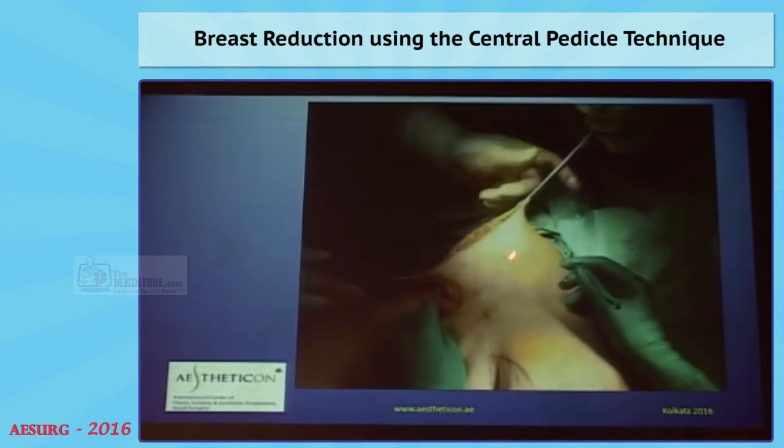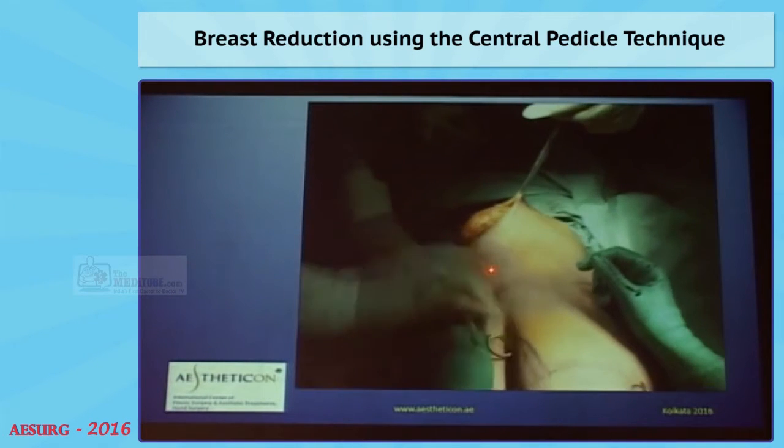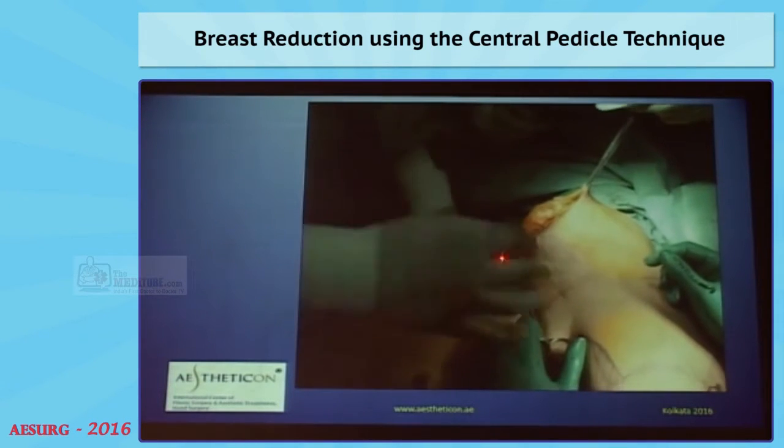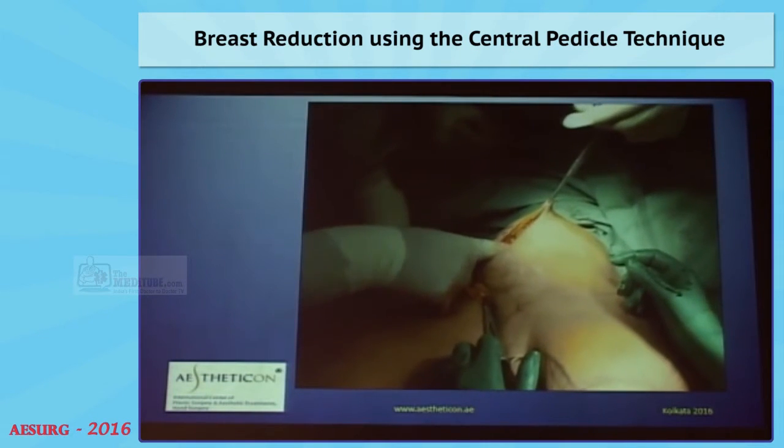So after dissecting, I just check on the size of the breast by wrapping it into the skin and see if I like the projection and everything, then I decide where to resect.